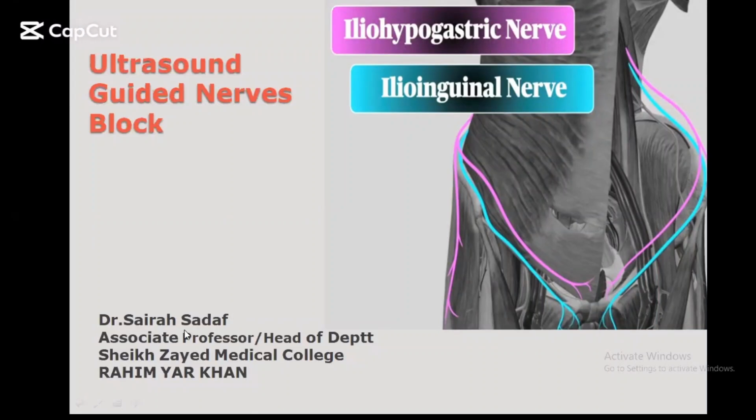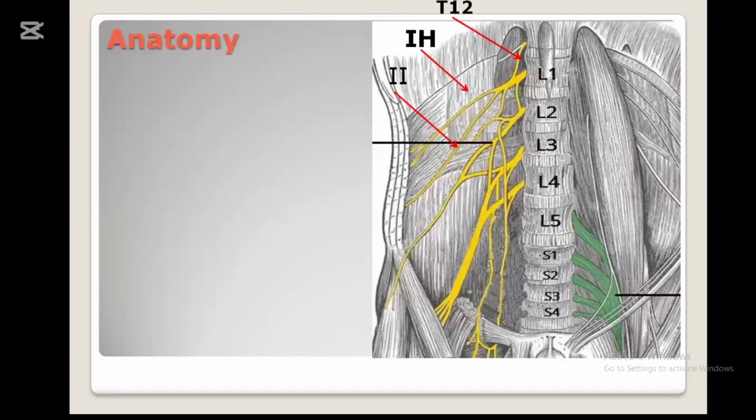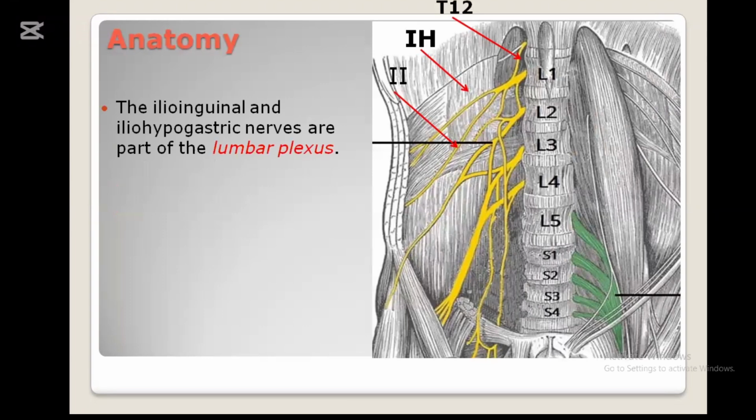I will be discussing the ultrasound guided nerve blocks, iliohypogastric and ilioinguinal nerve. I will be briefly discussing anatomy, techniques, procedure, complications, and the most important segment of my lecture will be indications. So let's have a brief recall of the anatomy.